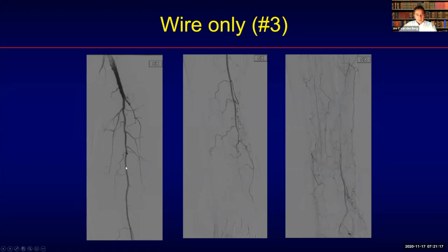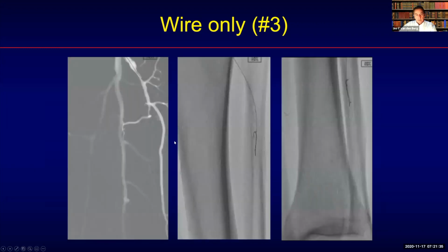Here another patient, again a single vessel runoff, and the target vessel in this case was the anterior tibial artery and the dorsalis pedis that you can see here. An occlusion after several centimeters in the anterior tibial artery. And as already mentioned, I always try antegrade first, just like I would never try first initially with a retrograde stick.